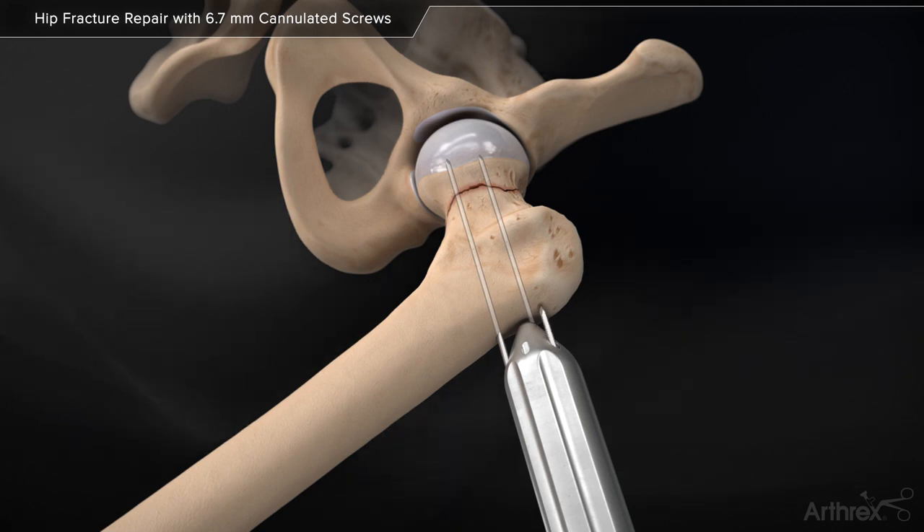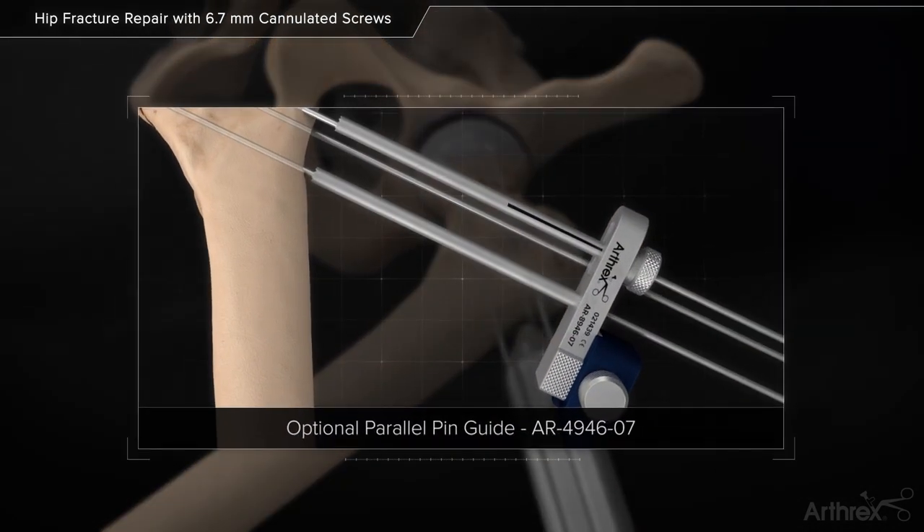Insert the remaining 2.4mm 12-inch guide pins through the selected holes. Parallel Pin Guide: Place the guide over the previous wire and adjust the movable sleeve to the desired position.